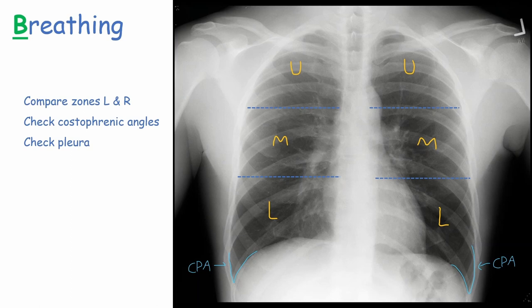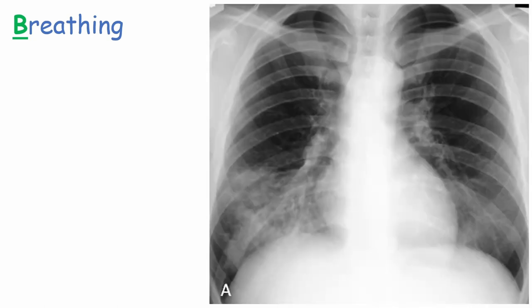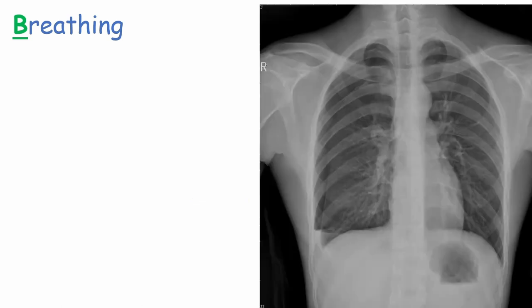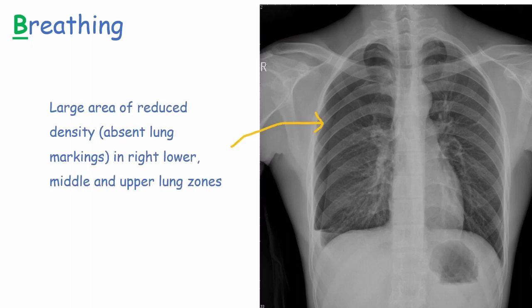Let's have a look at some chest X-rays with abnormalities in B, Breathing. This patient has a large focal area of increased density in the right lower zone — this is a right-sided pneumonia. Notice the asymmetry between the left and right lower zones because of the opacity. When the area of increased density is caused by fluid in the alveolar airspace, we call this consolidation. This next patient has a large area of reduced density, or absent lung markings, in the right lower, middle, and upper zones laterally — this is a pneumothorax.